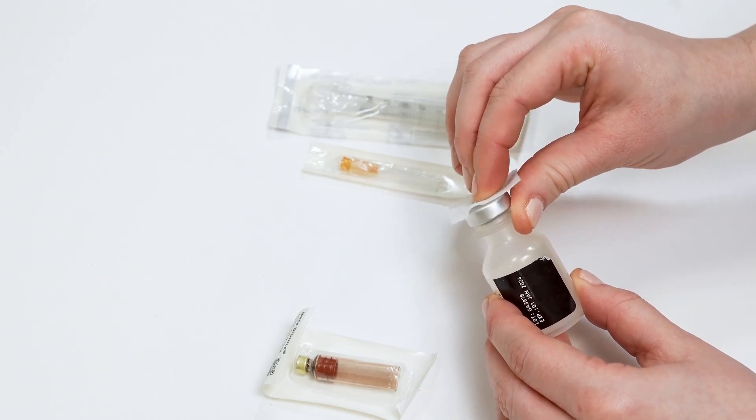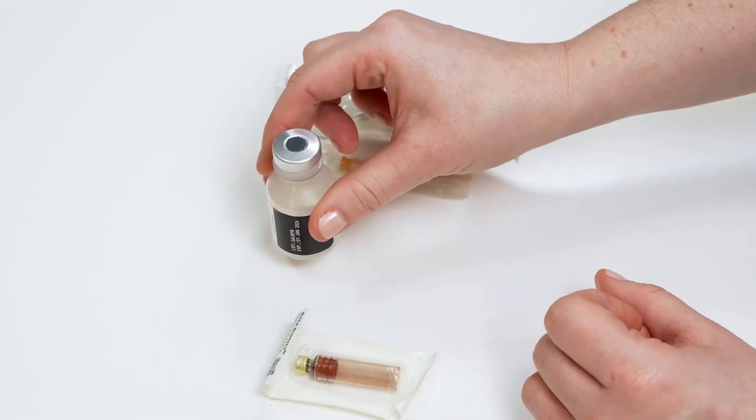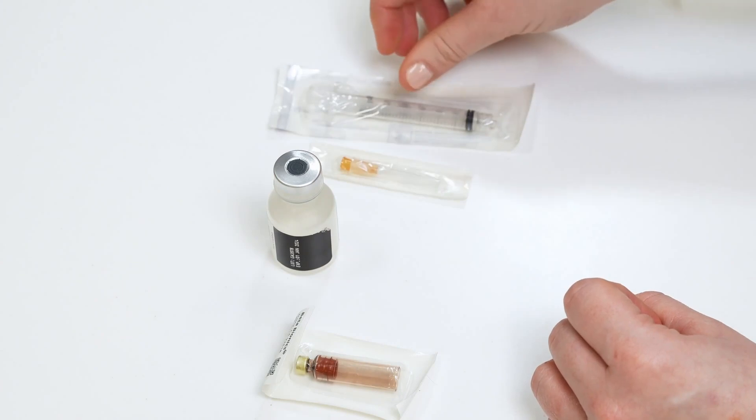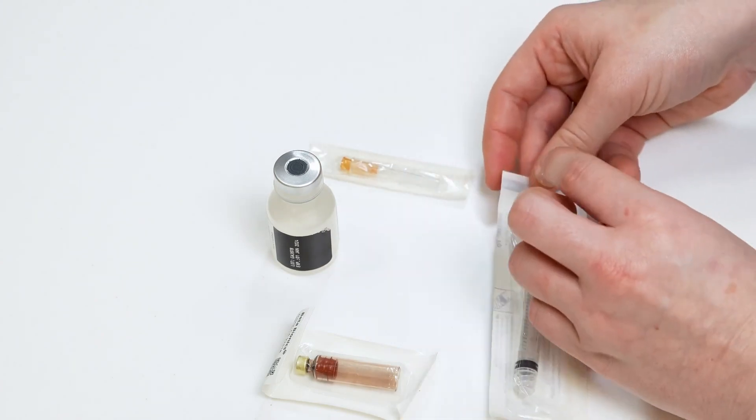First, wipe the top of the insulin vial with an alcohol wipe and let it dry. Next, open the syringe package and remove the syringe from the packaging.